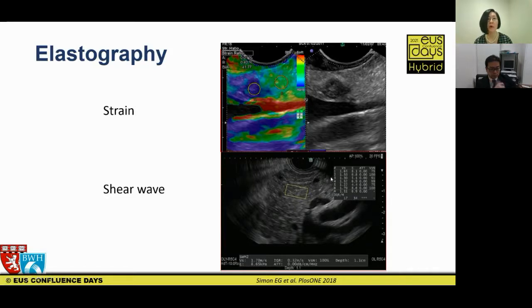And then you take multiple measurements as seen here with the VS showing you the velocity. And then the right side column called VSN is actually a reliability index, basically telling you how reliable your measurement is. And you want that to be as close to 100 as possible, which most of these values are.